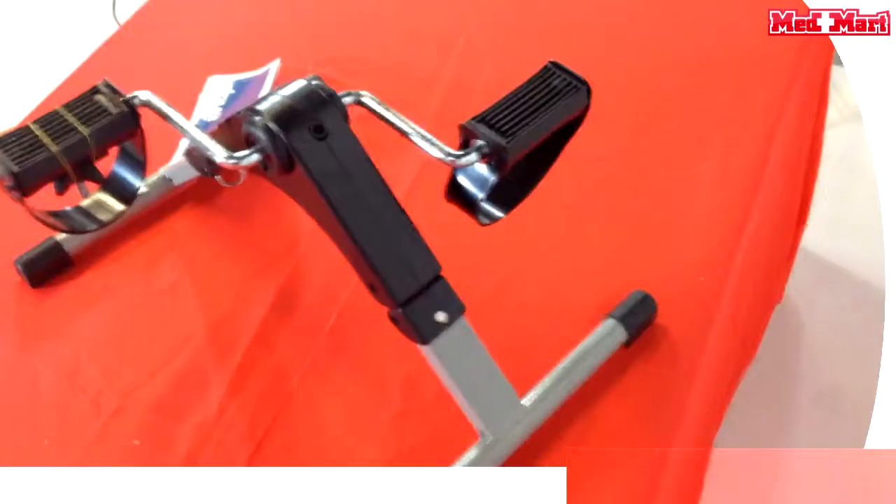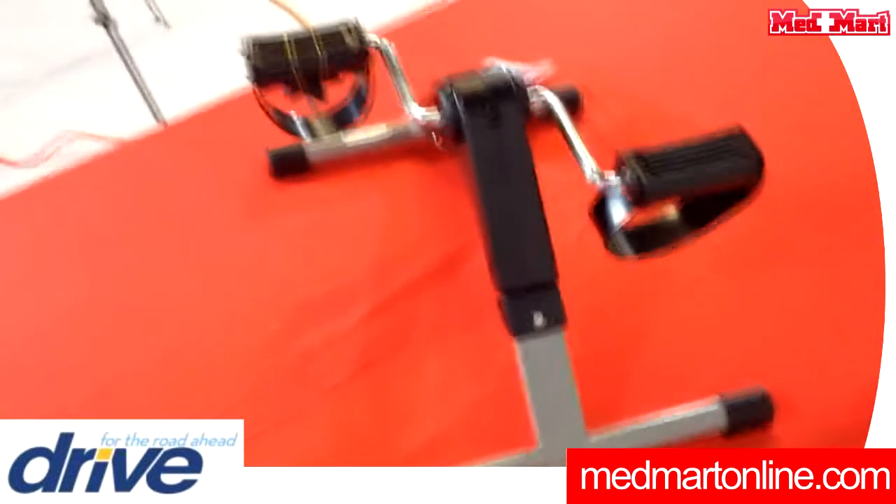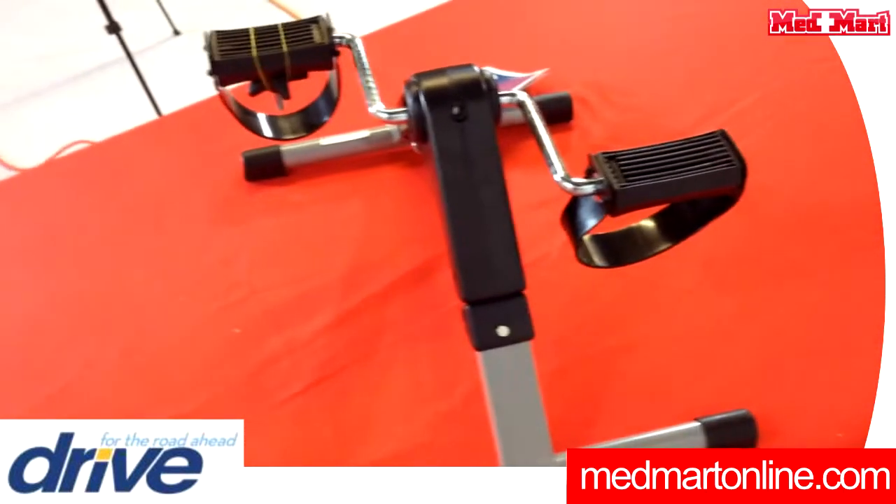The best thing about this peddler is you can use it in front of the TV while watching, or even while babysitting your grandkids as they play board games. It's a very versatile unit and a great way to keep moving and exercising. This is a great gift for the holidays — a great gift for anyone you're trying to keep active.